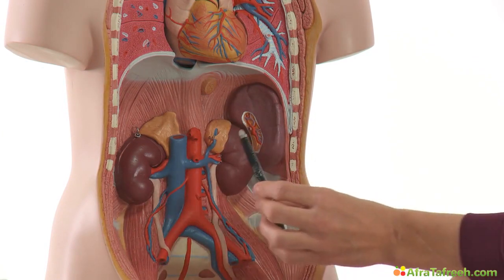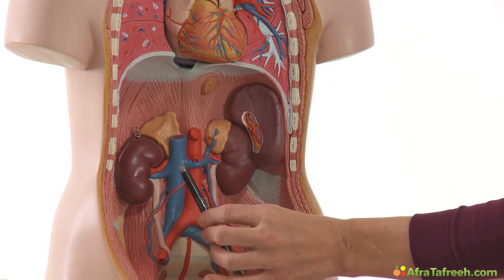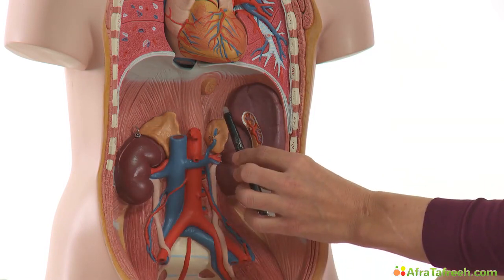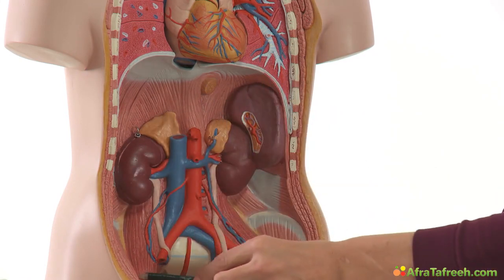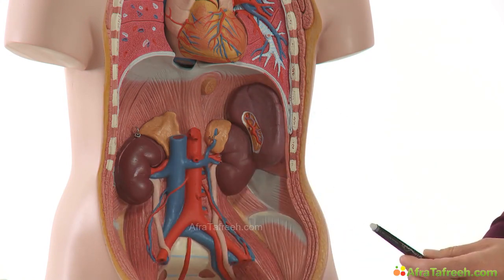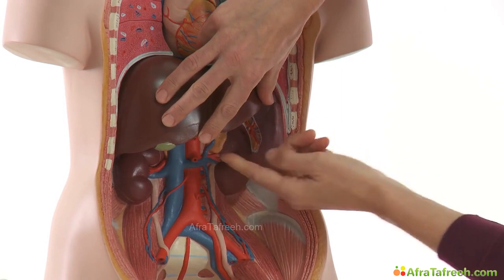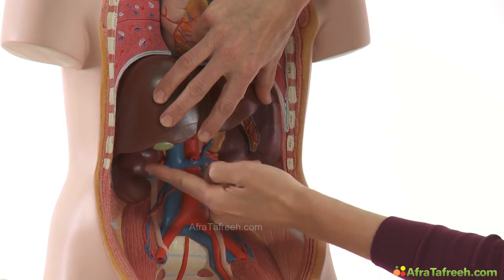And we can easily see that the aorta is near the left kidney, the IVC near the right kidney. And these two caps over here are the left adrenal gland and the right adrenal gland. And we can also see the psoas muscle here on both sides, where the kidneys slide up and down with a breathing movement. Another neighboring organ is the liver with the gallbladder.